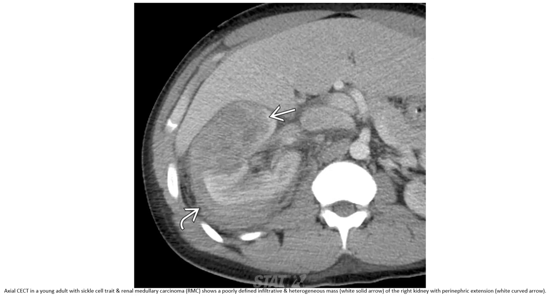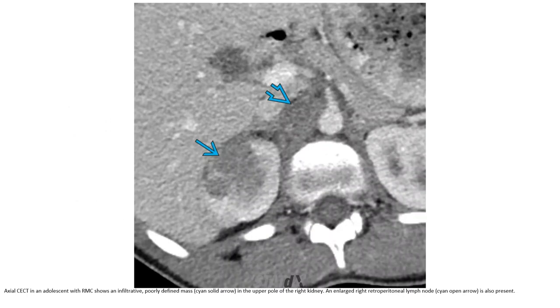On contrast CT, in a young patient with sickle cell trait and renal medullary carcinoma, the tumor appears poorly defined, infiltrative, and heterogeneous, involving the left or right kidney with perinephric extension.